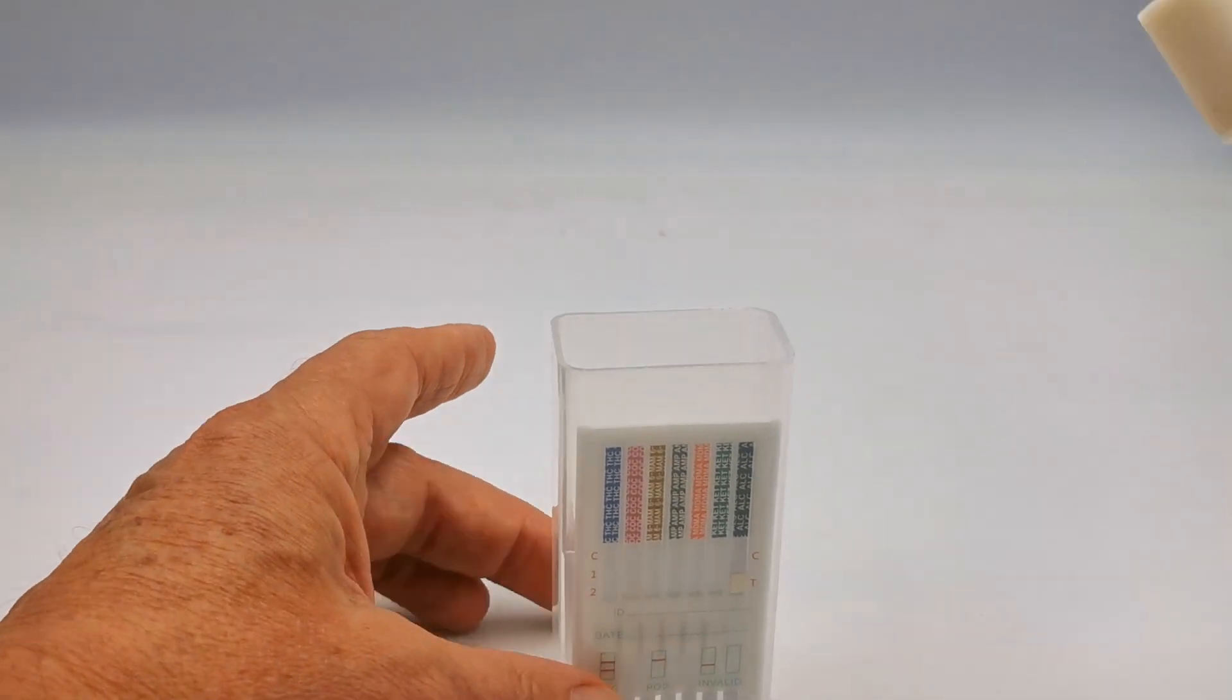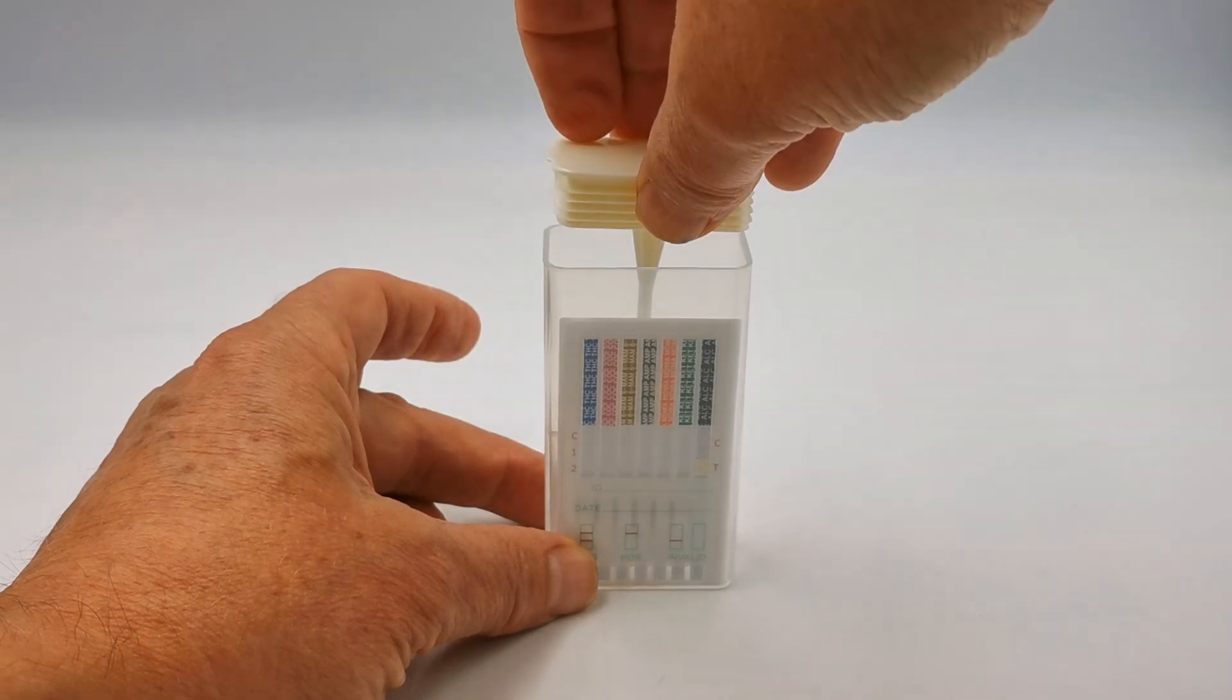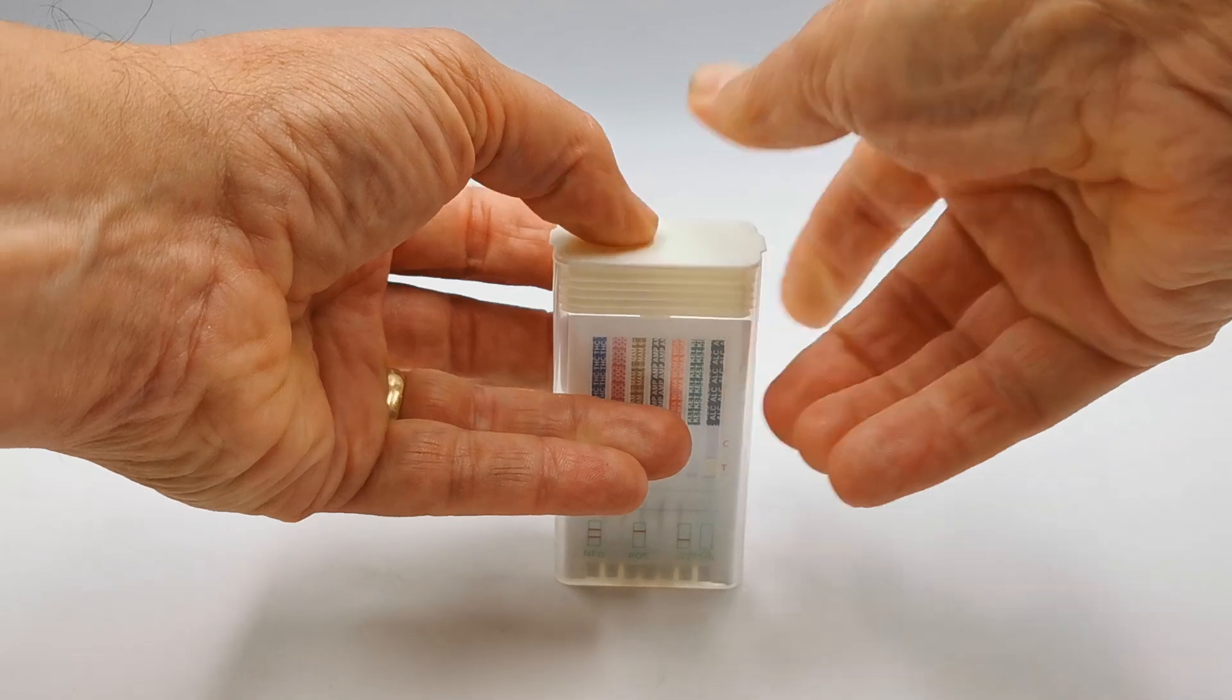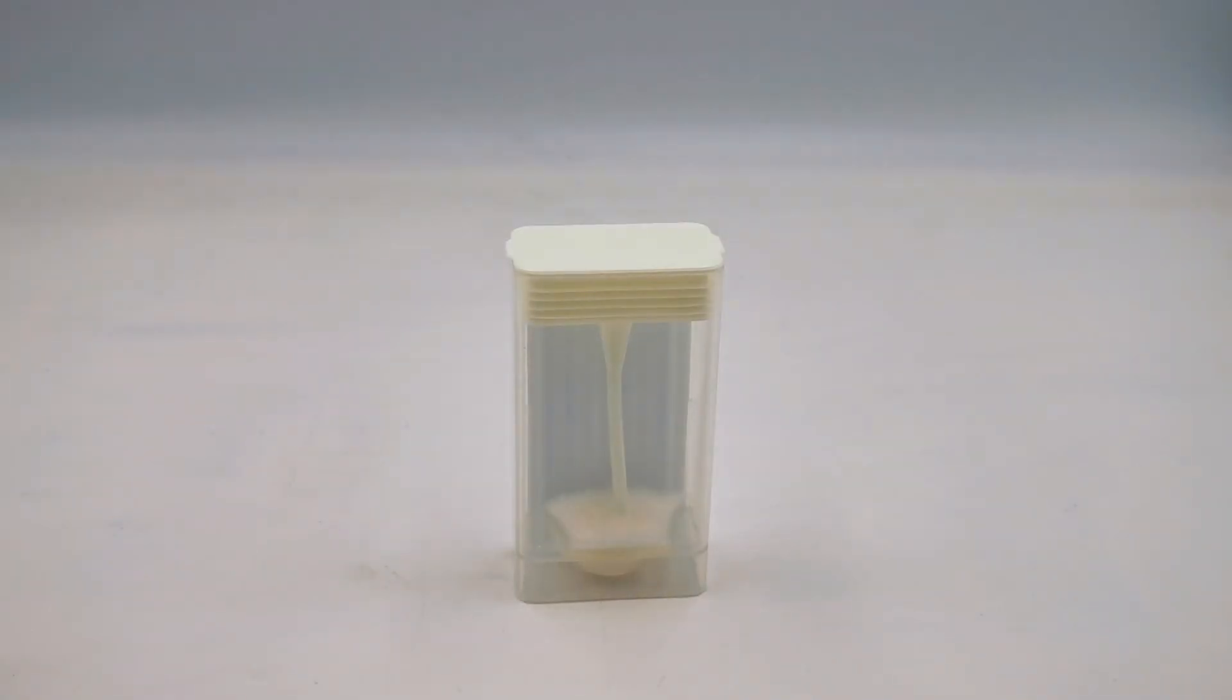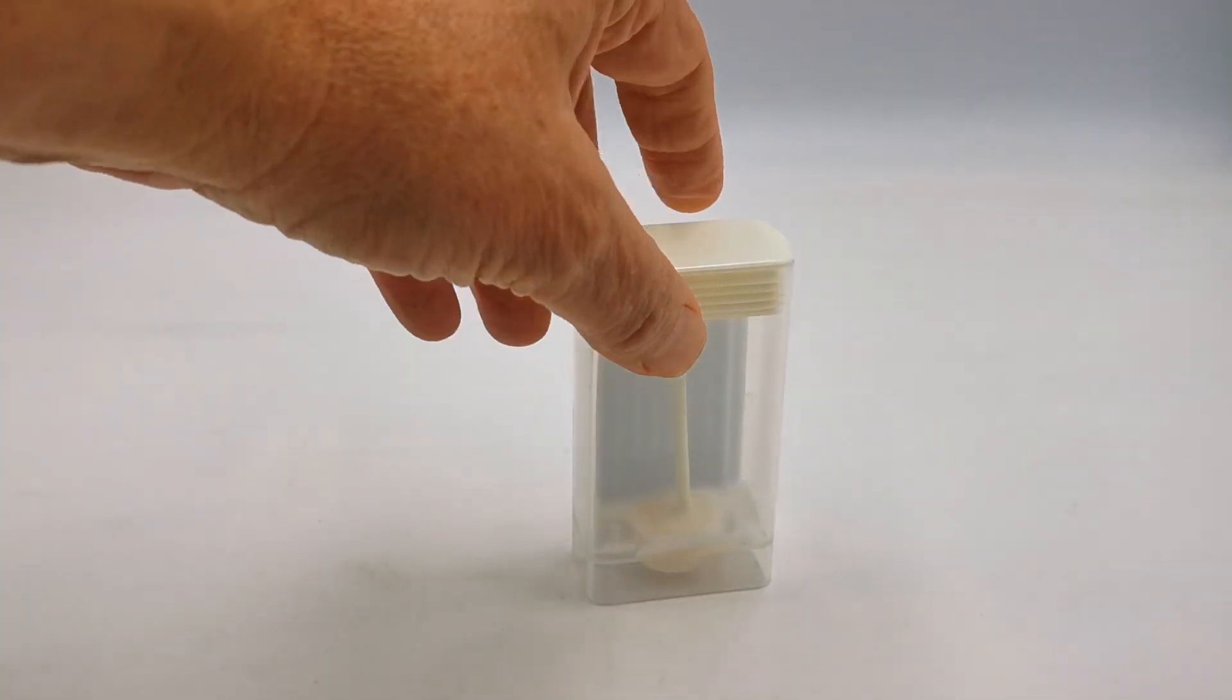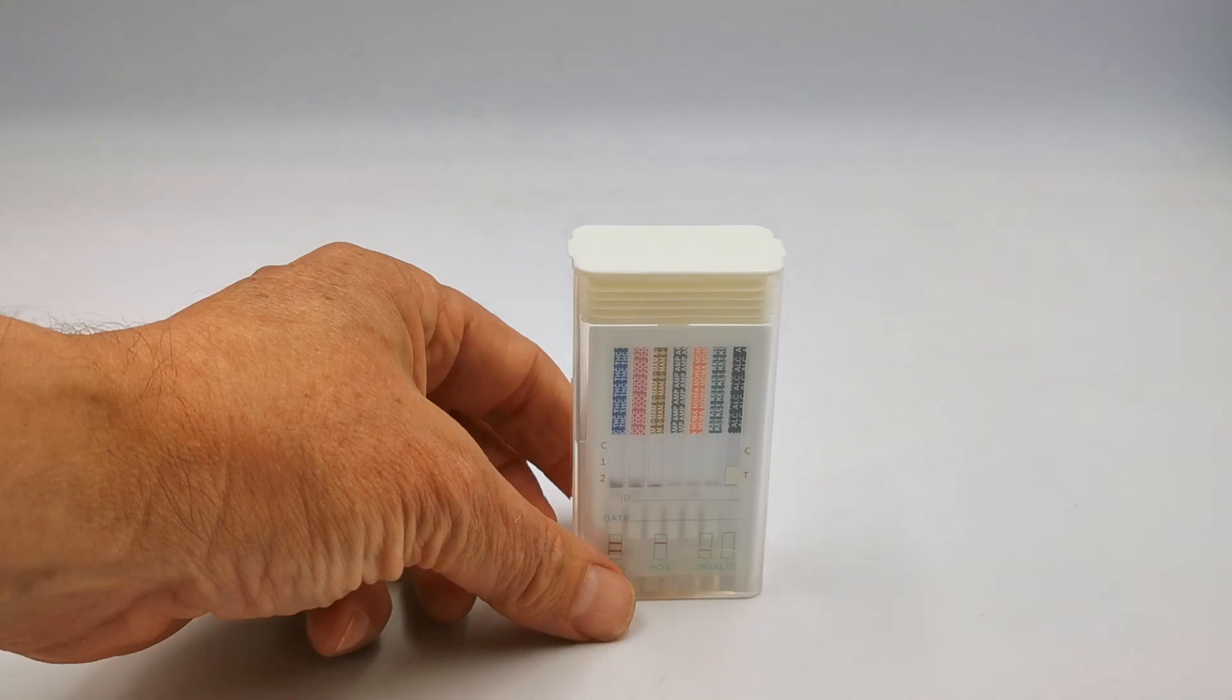Now I'm going to assemble this test with the cube in an upright position. Just introduce the swab and push down firmly, and that will dispatch the saliva from the swab into the base of the test. You can see there's excess saliva in there which will then start running these tests.